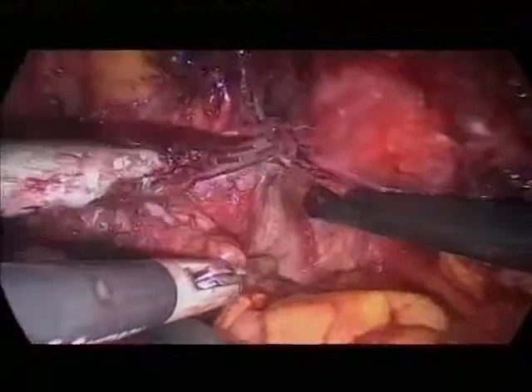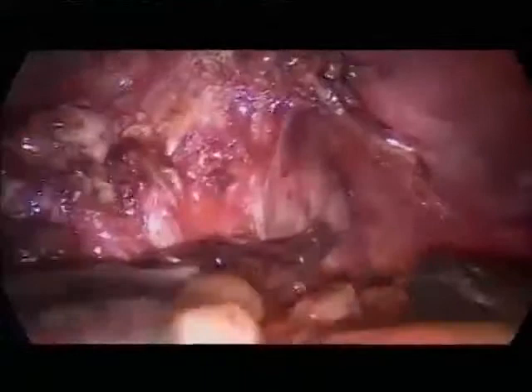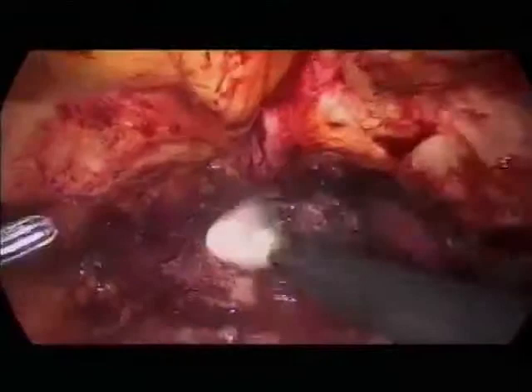You can see the muscle fibers of the levator. This is periprostatic fascia. So we have access to the prostatic capsule from anterior on both sides. You see that? And we need this later for the nerve-sparing procedure.